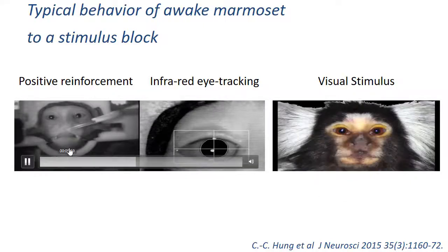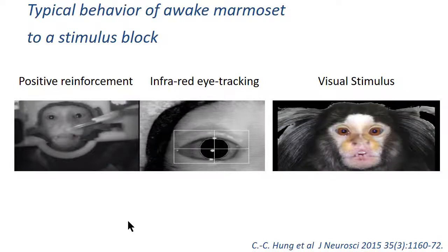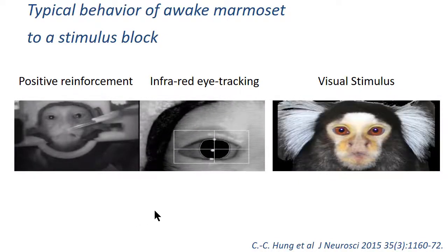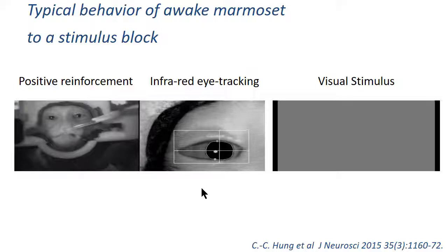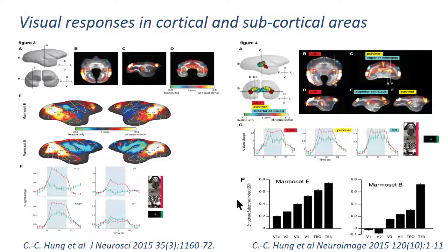And the stimuli come and the animal starts receiving the reward. So it's really a positive kind of task for the animals. They enjoy participating in this kind of task. You see how the animal is maintaining its gaze on the screen really well. And then once the stimulus disappears, you immediately notice that the animal is saccading all around. Again, the reward stops, and then the animal goes back to its resting condition.